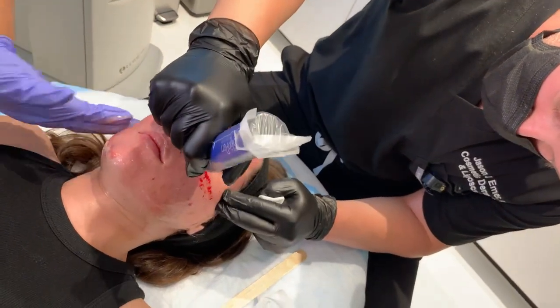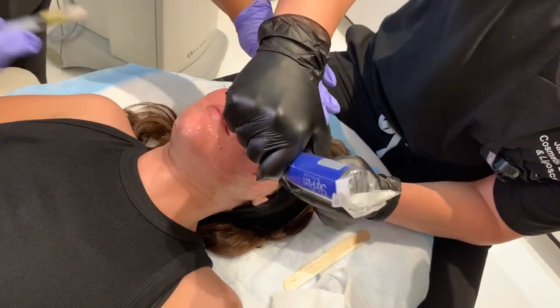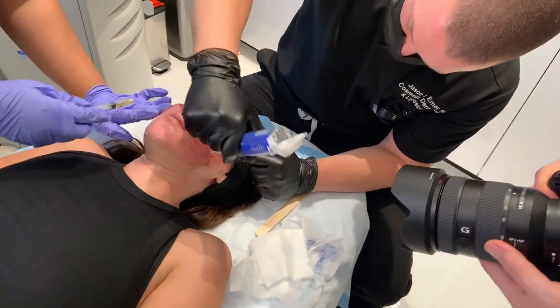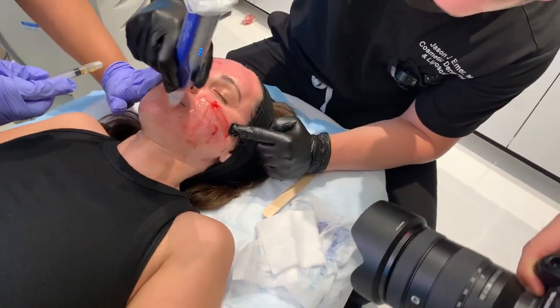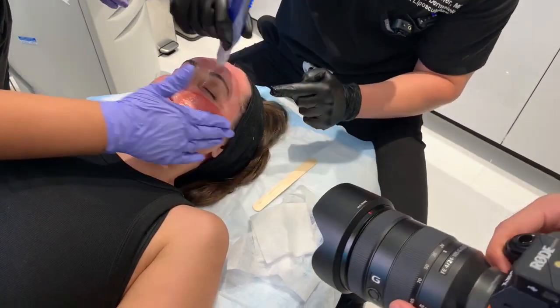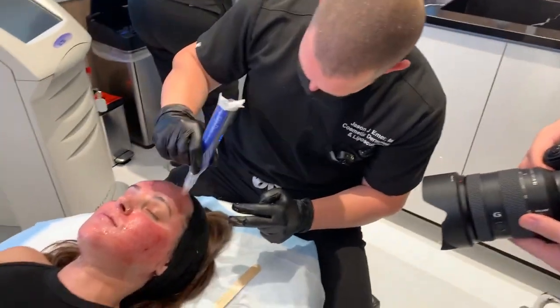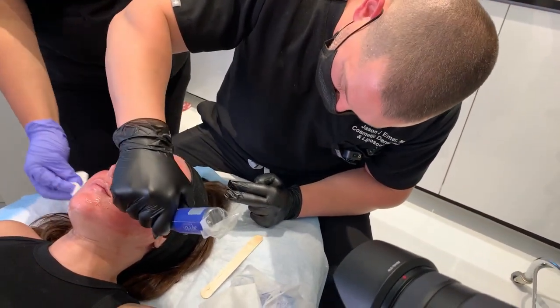And then that's it. How terrible was it? Not bad. Not too bad compared to what you would think, right? Mm-hmm. Especially with all the nerve blocks and everything. And I like having the blood here. We want to keep the blood on her skin. It really helps her rejuvenate and helps the healing process. And that's it. And then in 7 to 10 days, she'll be back to being a light pink and back to her normal activities, guys. Whatever questions they have, otherwise we're done.